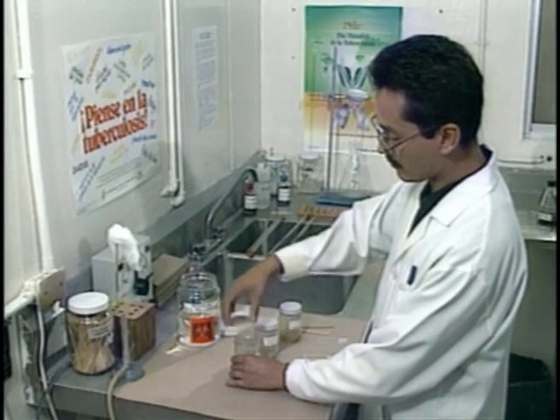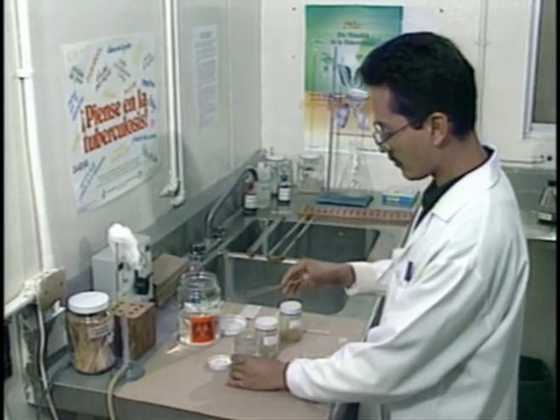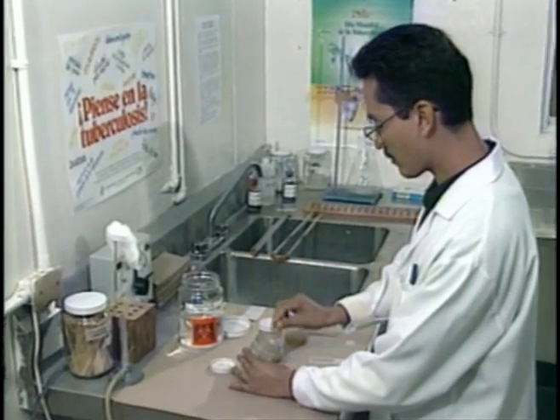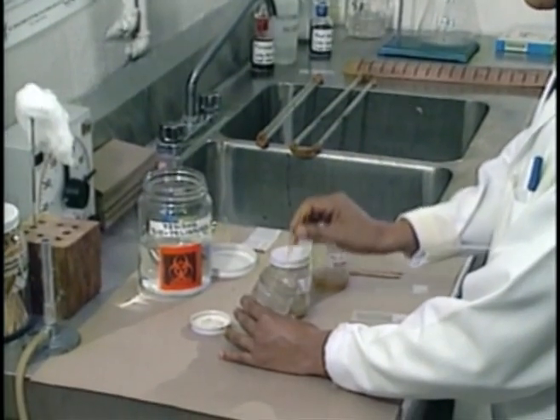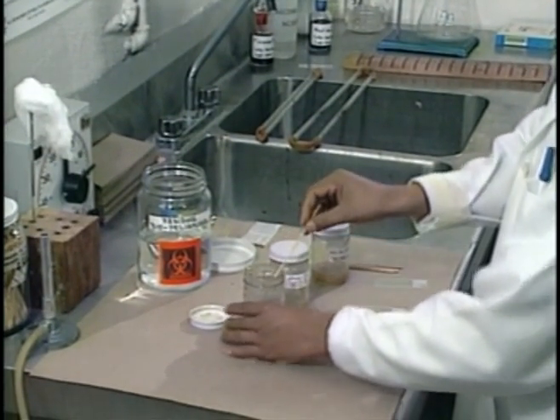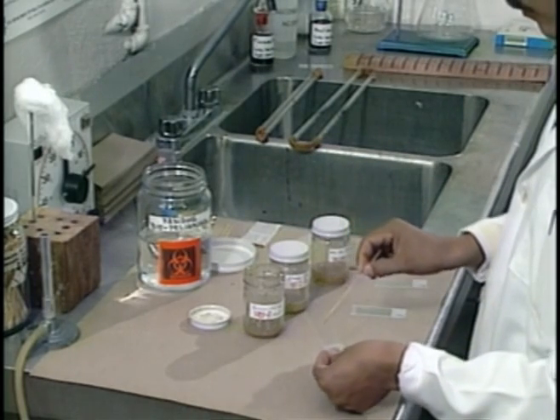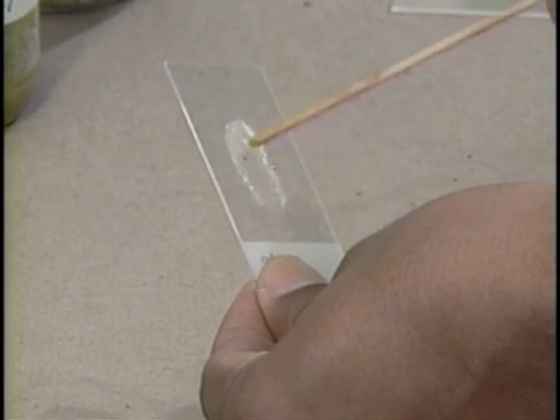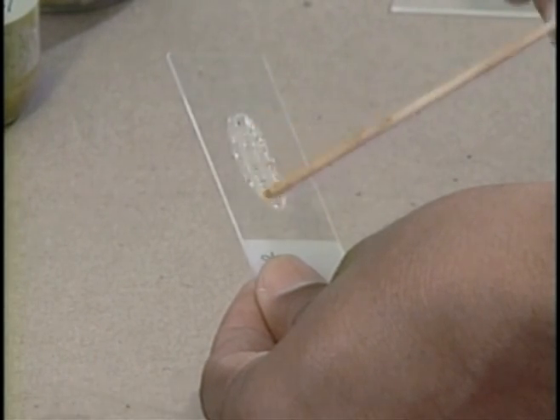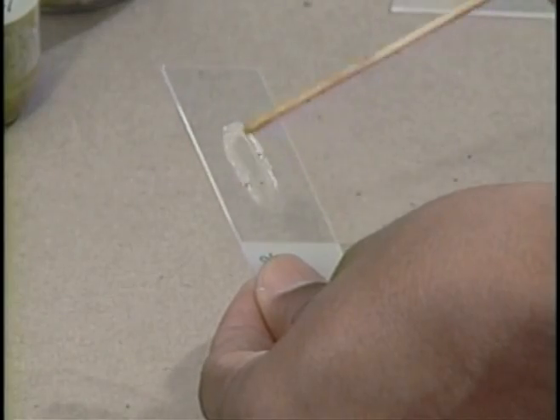Open the container slowly to avoid producing aerosols. Using either a wooden applicator stick or a loop, pick out portions of sputum for examination. Solid caseous particles often produce the highest number of bacilli. Using a continuous rotation, cover an oval area approximately 2 centimeters in length on the slide. Put only one smear on each slide.